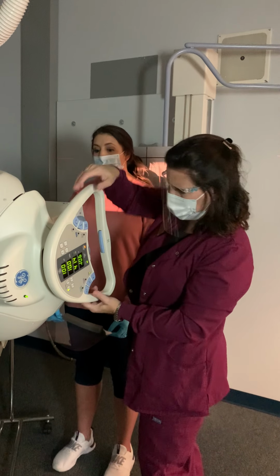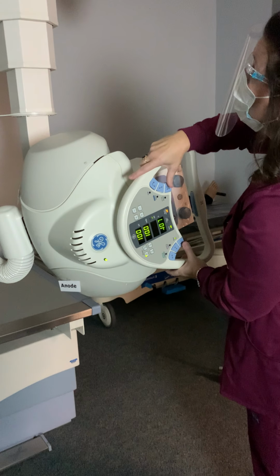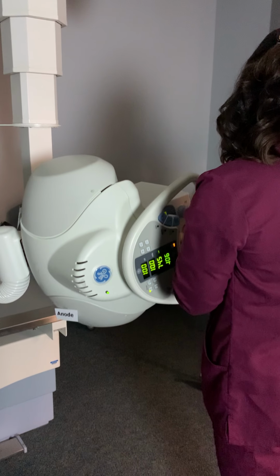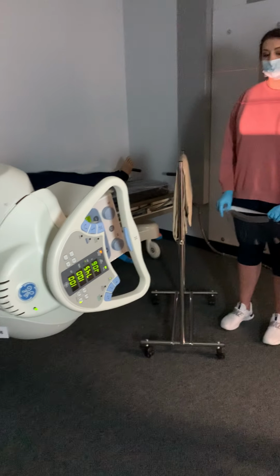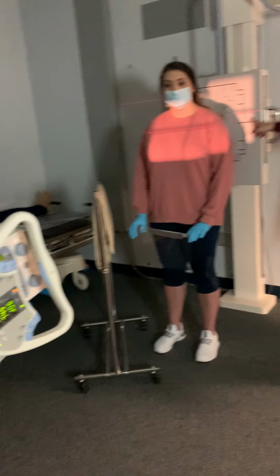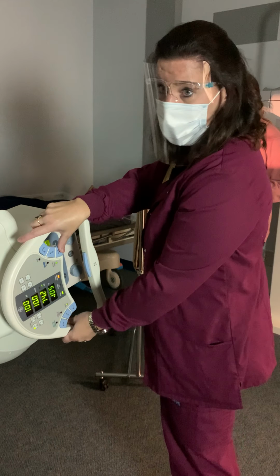And that one holds, okay? I'm just testing theories. One of them doesn't work, and I can't remember which one it is. There it is. So you have to change. See, that's set at an 8 by 12 for 72 inch SID, but that's not what we're using, are we? See how it doesn't stay inside the field of view for a 14 by 17. So it's the 72 inch. So at 40 inches, you're okay with angling with your collimation.